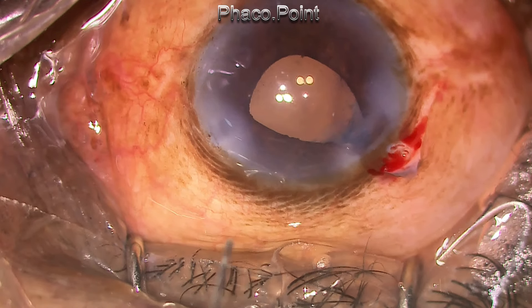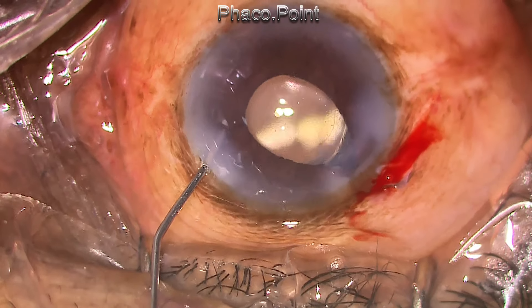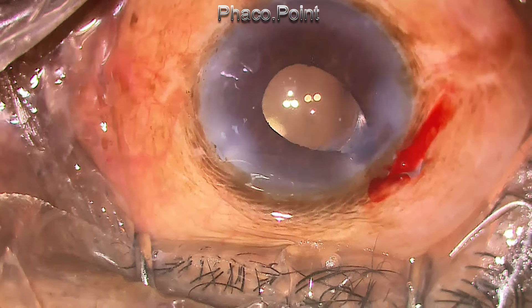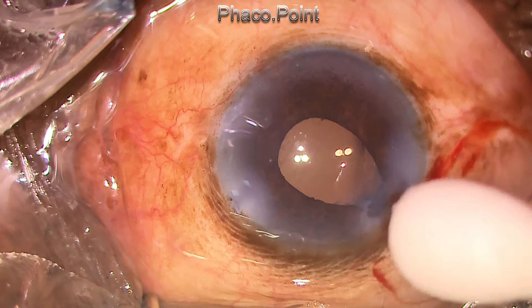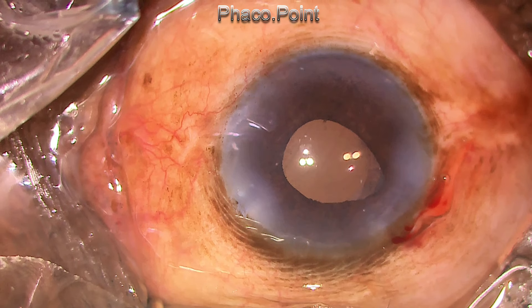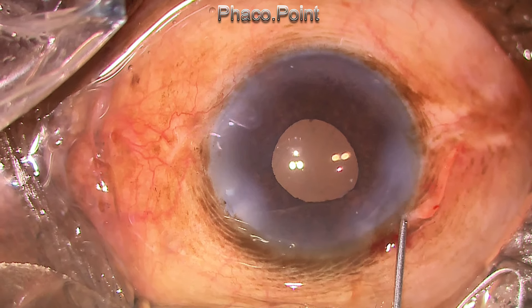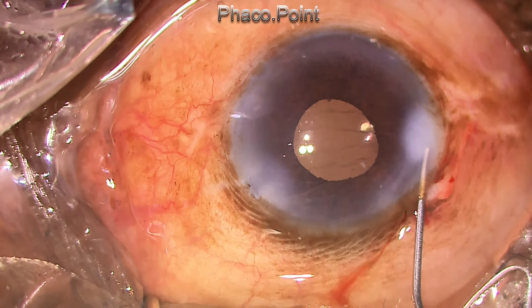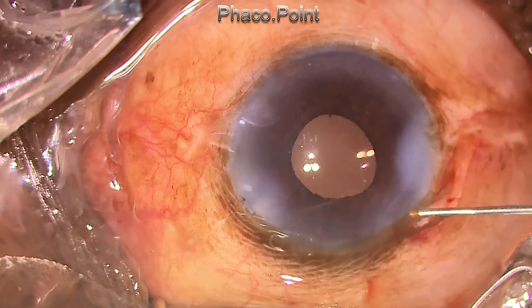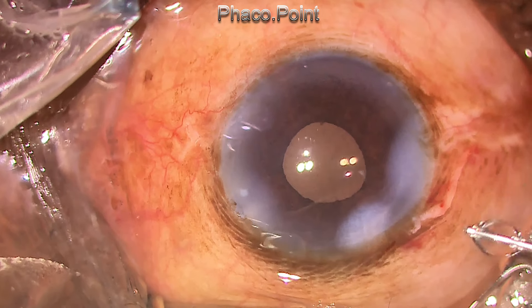To manage the iris incarceration, balanced salt solution is first let out from the side port incision, making the eye hypotensive. Then gently tapping over the main incision is enough to cause the iris to settle. The key lesson: do not try to push the iris back. Make the eye hypotensive so that the pressure inside the eye becomes low, and the iris will fall back on its own.